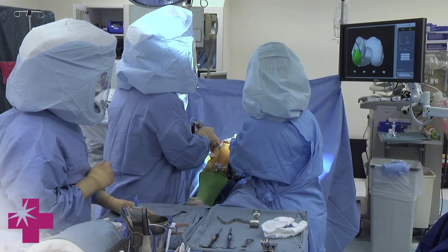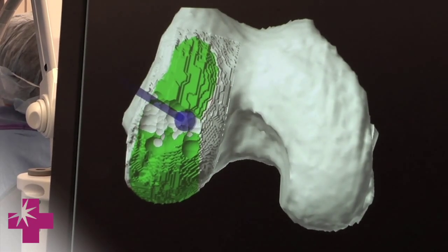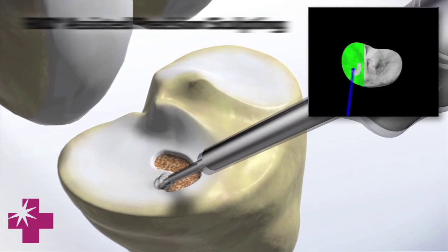In the operating room, this is what we're looking at on the computer screen — again, just like GPS. As we're doing the operation, we're watching this screen so we can tell exactly where the cuts are being made, what the implants look like, and how the knee is reacting to what we're doing. It's all done in real time.